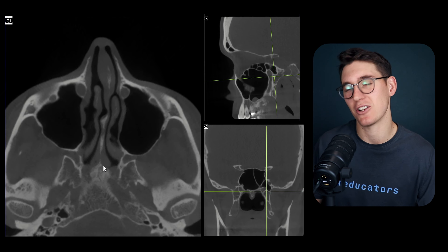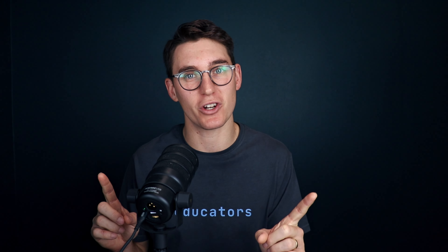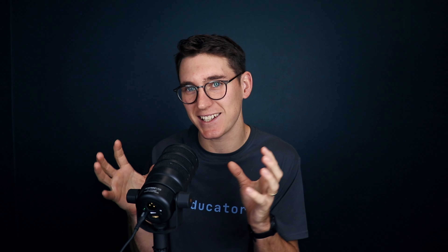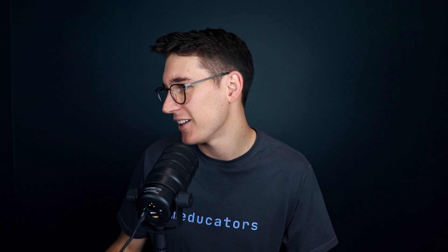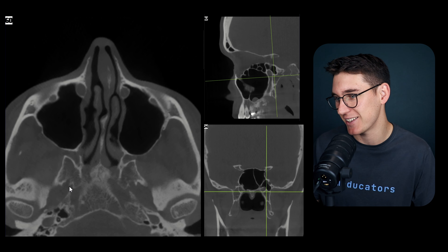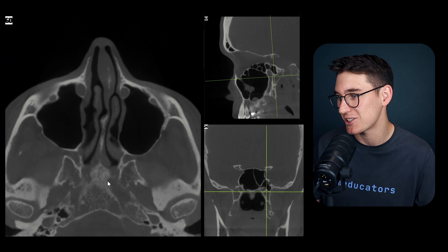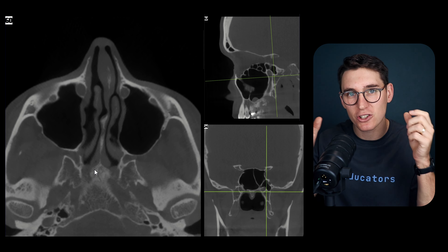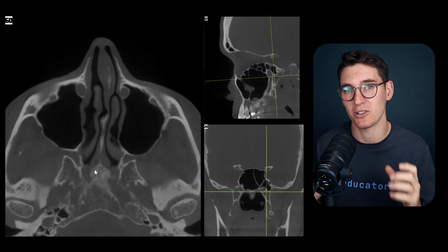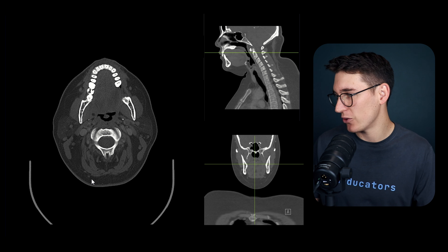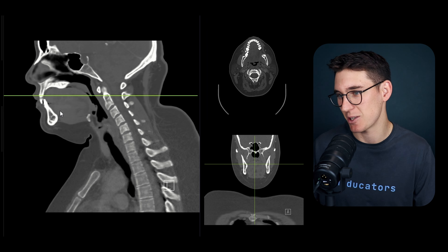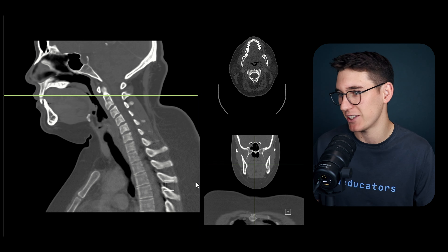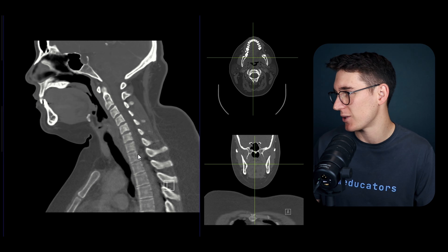Now let's look at our last bone, the mandible - which is a little controversial since some don't include it in the viscerocranium as it's not technically attached to the skull. The detailed scan we've been using doesn't include the mandible, so I'm switching to a CT scan of the cervical spine which will capture the mandible nicely. Let's get our orientation.